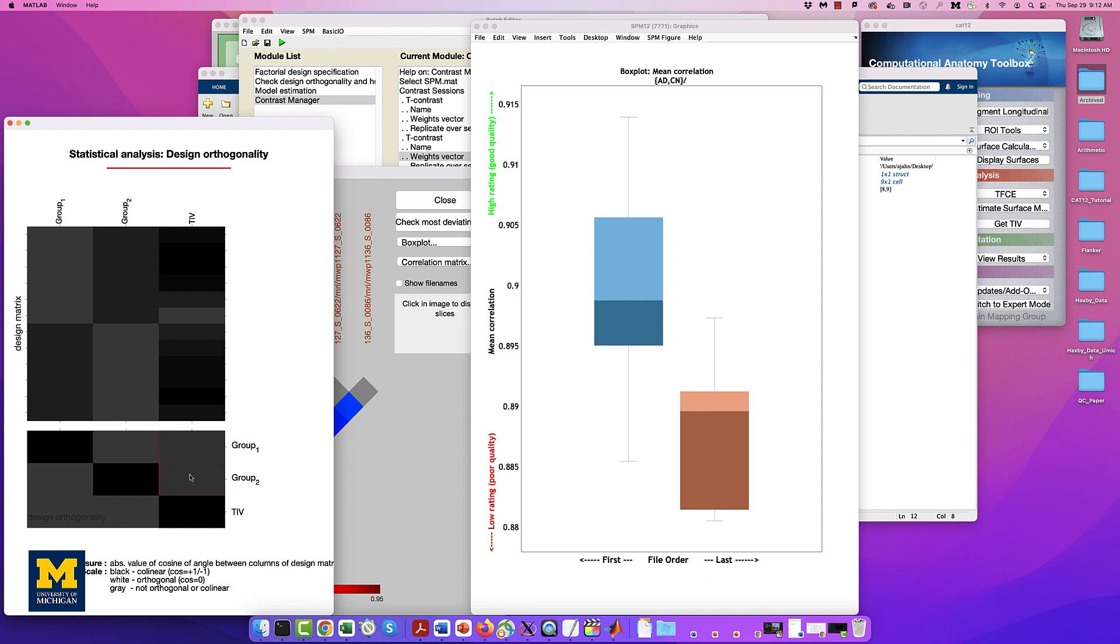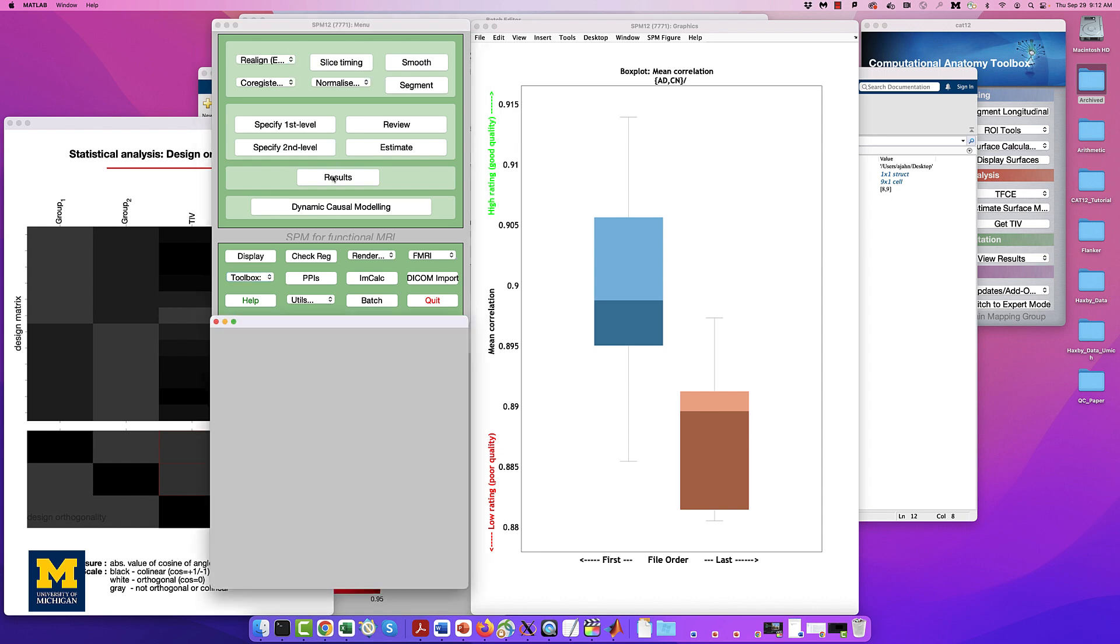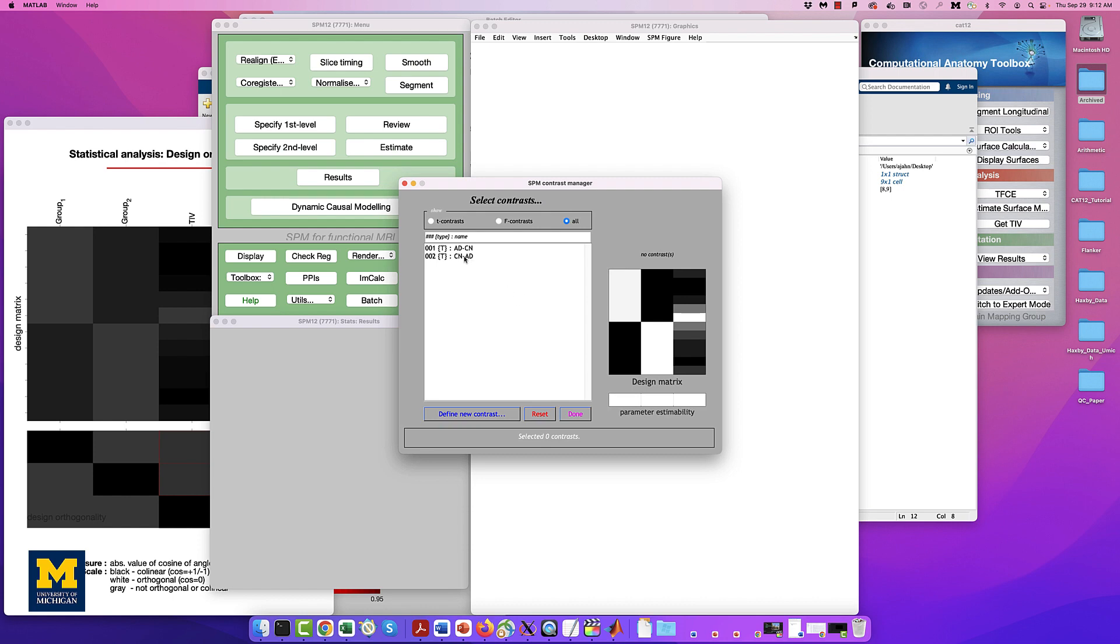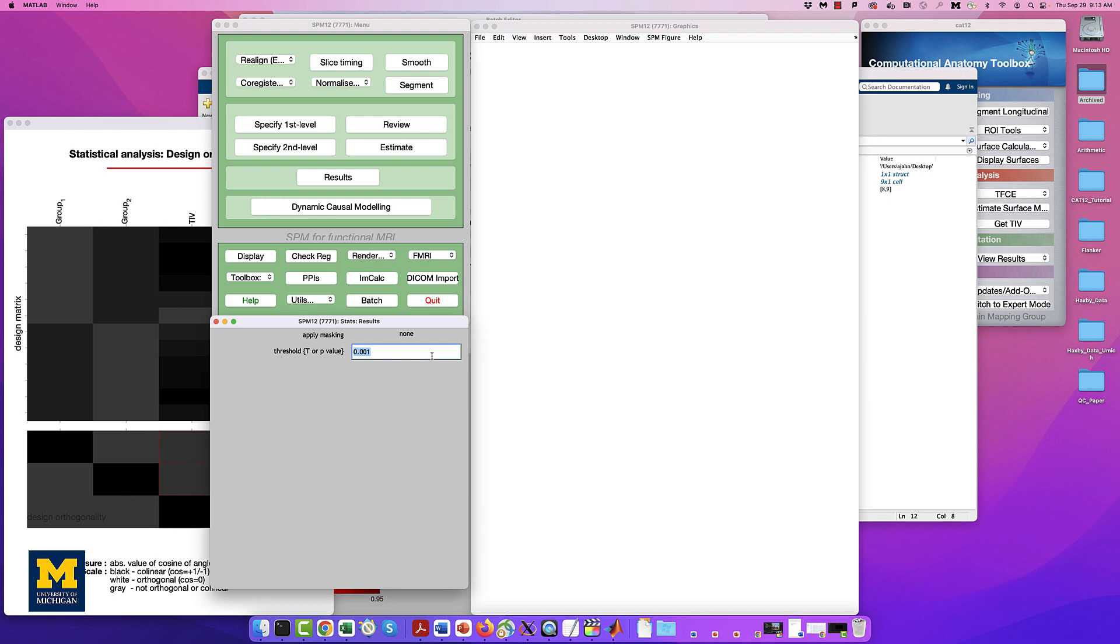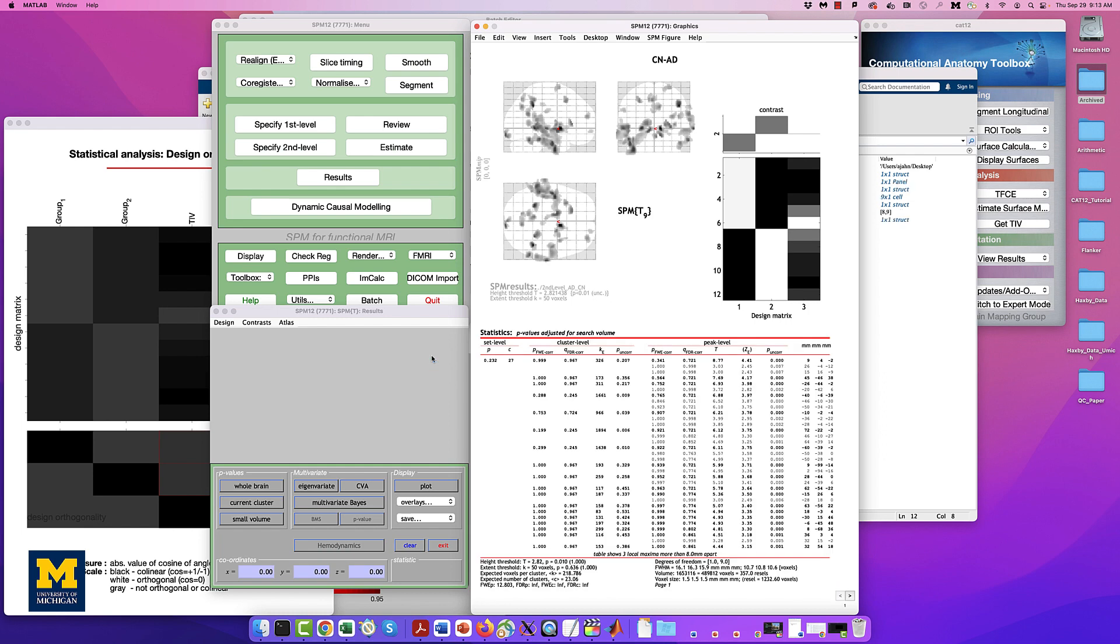Now that we have estimated the model and generated the contrasts, we can look at the results just like we would the results from an fMRI experiment. From the SPM12 GUI, click on Results, and select the spm.mat file in the directory 2ndLevelADCN. When the Contrast Manager appears, select the contrast CN-AD and click Done. From the Viewing options, select the following. Apply Masking, None. P-Value Adjustment to Control, None. And then a value of .01, and an extent threshold of 50. These numbers are arbitrary, selected in part because we only have 6 subjects per group, and therefore relatively low power. You can see that none of the results pass correction.